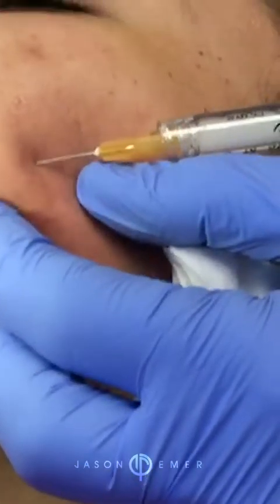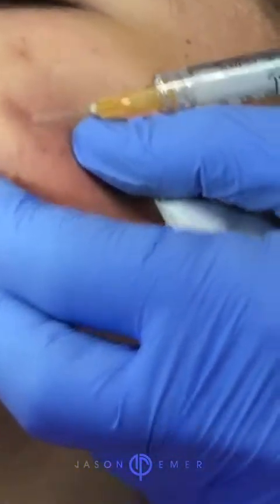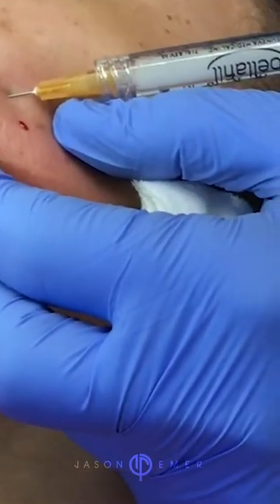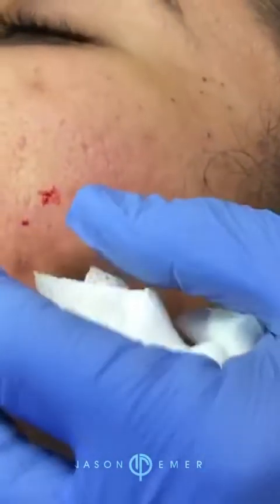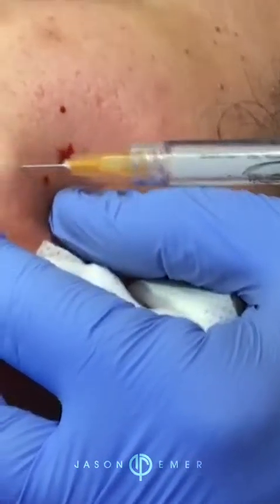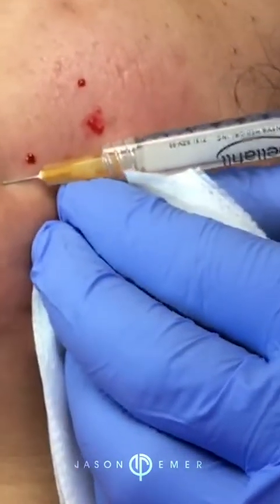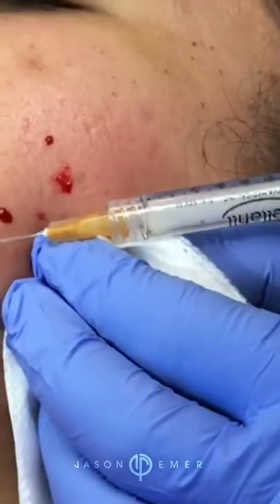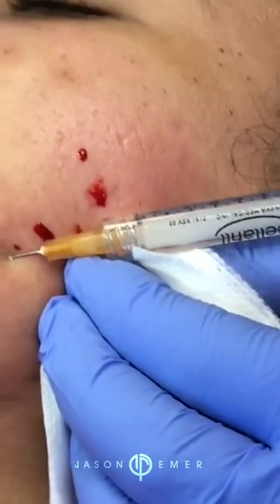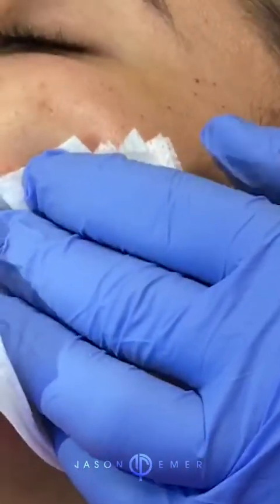What this does is it goes right under the surface of some of those scars, and we deposit a little scaffold of this material, which is made of something called PMMA, or polymethyl methacrylate. If you read about this on Google, you're going to see all these horror stories of people getting terrible PMMA injections to the buttock. Now, this is not pure PMMA. That's either silicone or impure PMMA that's not coming from the United States, and these people are doing this in back alleys or in hotels, which I would not suggest doing, especially in the buttock area.